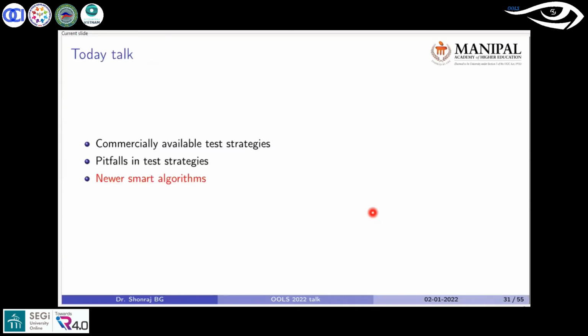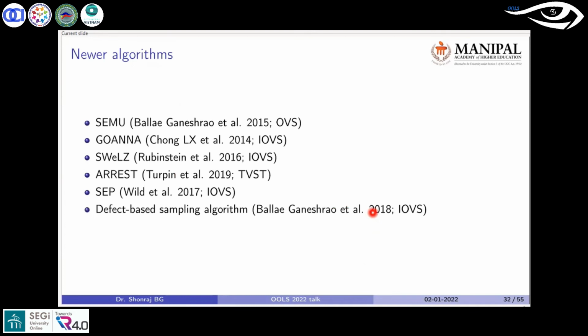So with this in mind, the newer algorithms that perimetrists, or people in perimetric research like me, are working on, are working towards improving these two main issues. That is, how can I make it accurate and precise, and how can I make it pick up small scotomas. So there are many newer algorithms that have been developed. None of these are implemented in the commercially available test algorithms, unfortunately, but these are all in the research stage. Many of them were published long back.